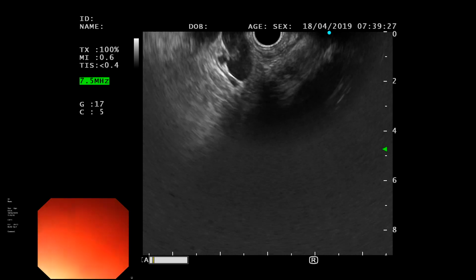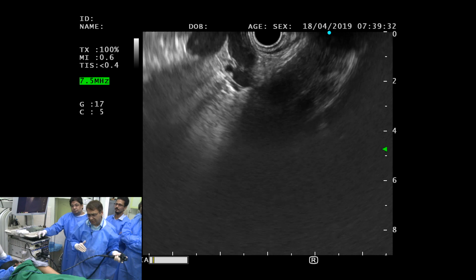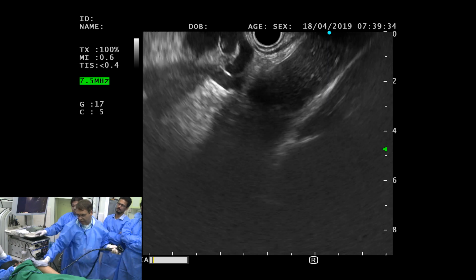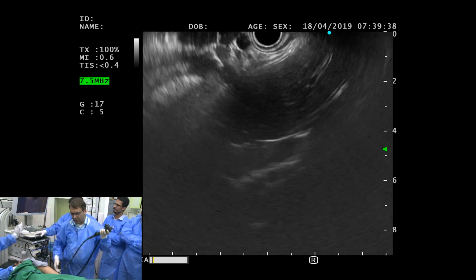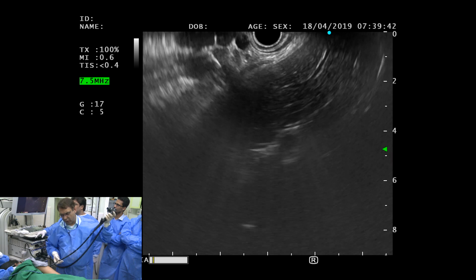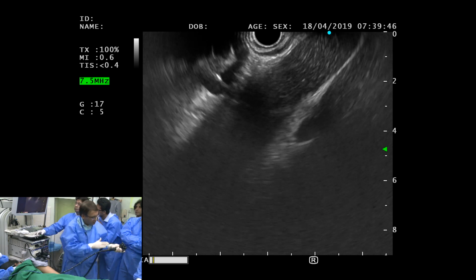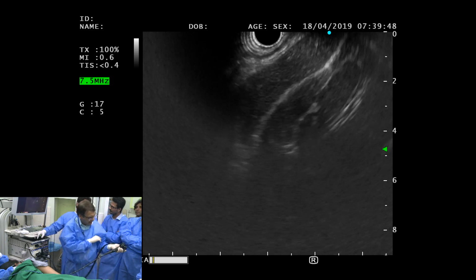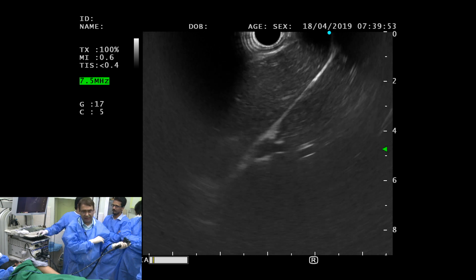So here you can see I step back a little bit away from the patient. If it's Dr. Saad or Giyasab, they can stay close because they're taller. They can hold the scope straight, even staying closer to the patient. For me, I have to step back, because every movement I do with my hand and wrist, I need to move it around like this, okay?